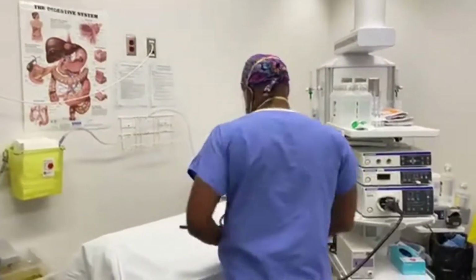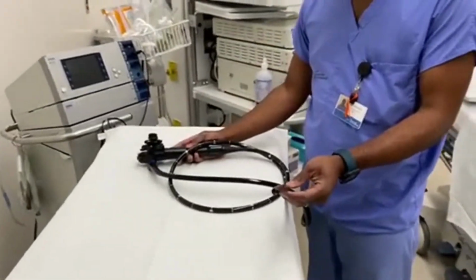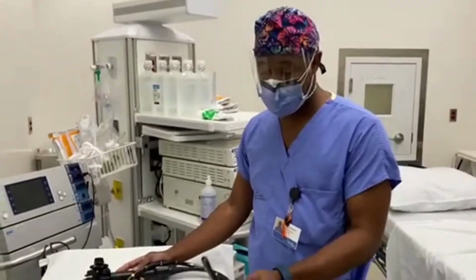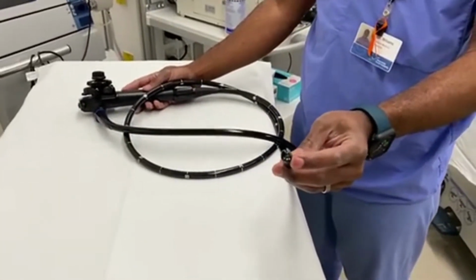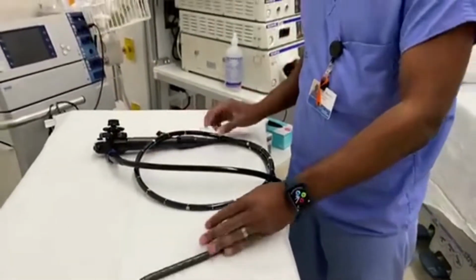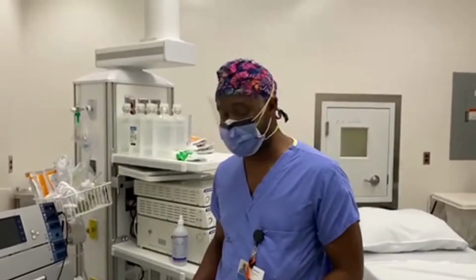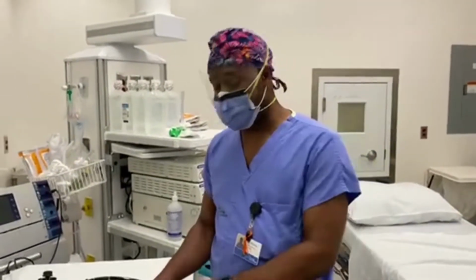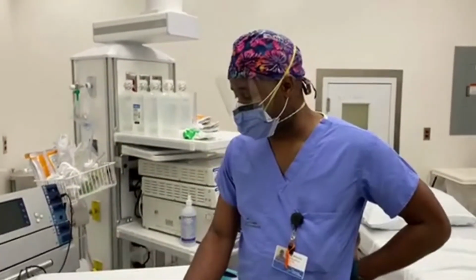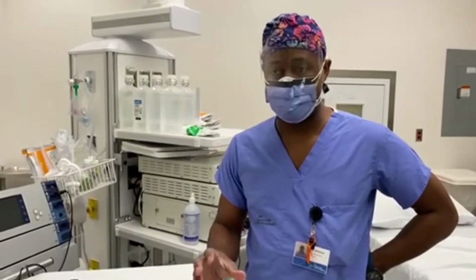So this is an endoscope, and as you'll see, it's a flexible piece of equipment. It's actually very expensive as well and high-tech. At the end of it, there's a light source. I haven't got it turned on right now, but there's a light source and a fiber optic camera. This one is actually for the upper GI tract, so it's called a gastroscope. The lower GI tract is assessed typically with a colonoscope, which is larger and longer because that part of the bowel is longer. These instruments allow us to very carefully and in a detailed manner inspect the GI tract.